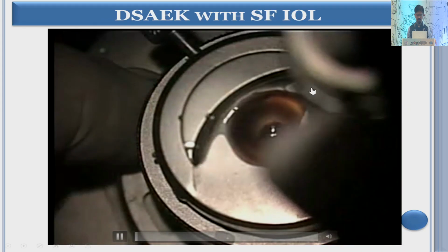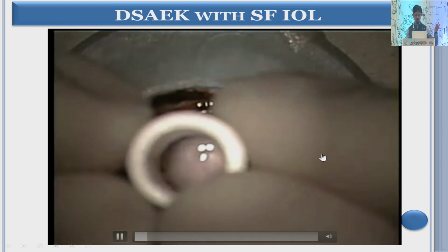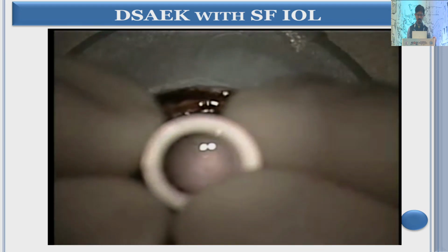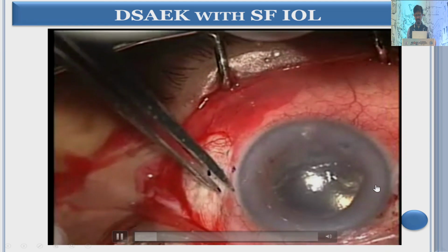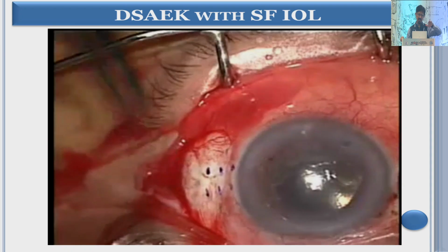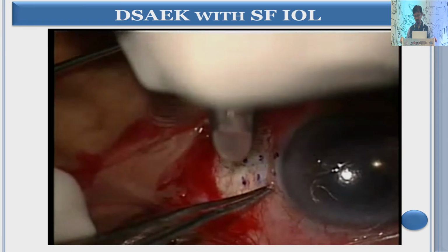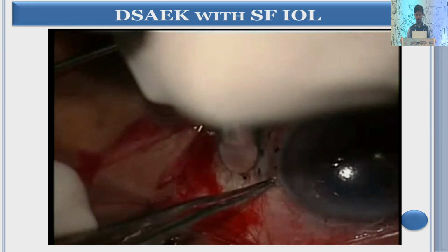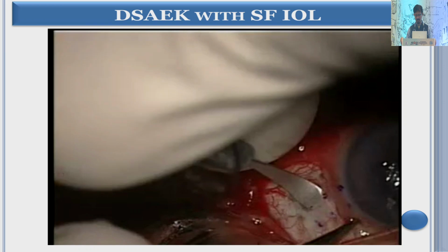And for an ultra-thin dissected lenticule, you first mount the donor tissue on a microkeratome, then cut the anterior lamella, and then create the donor lenticule. And then this is the case of pseudophakia with a tilted AC IOL touching the endothelium, causing endothelial decompensation. So we are planning to remove this AC IOL and do an intrascleral haptic fixation of IOL.